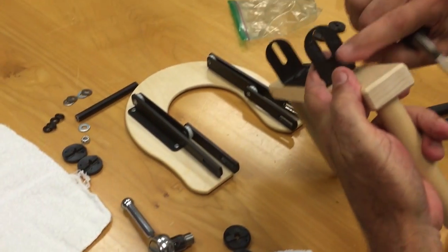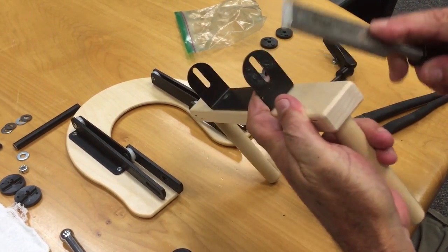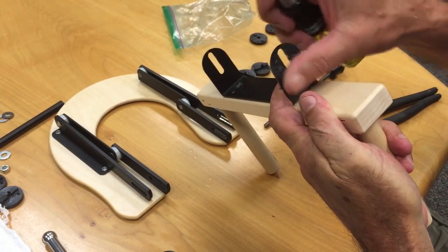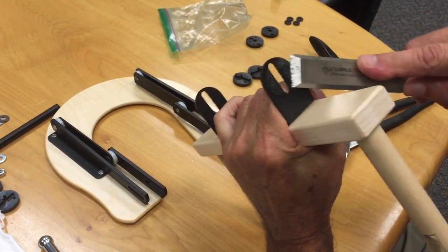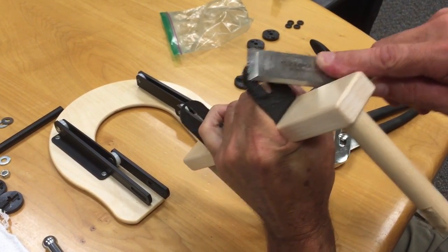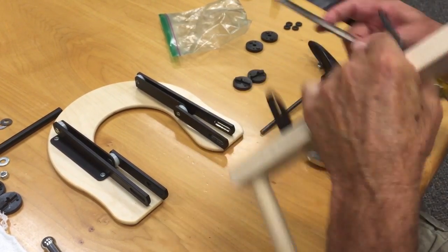Then you must clean the residual glue. There may be just a slight amount with a putty knife or something similar. The glue is only on the outsides. And you just want the majority off so that you can have a nice flat mating surface for the new discs.